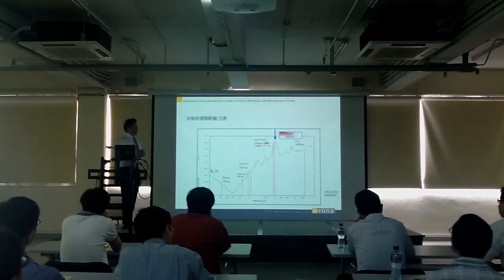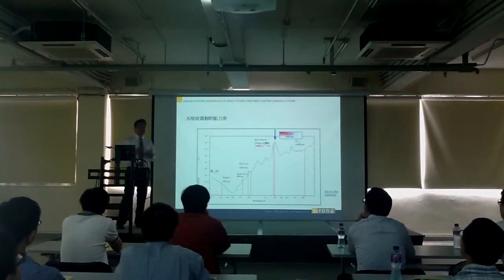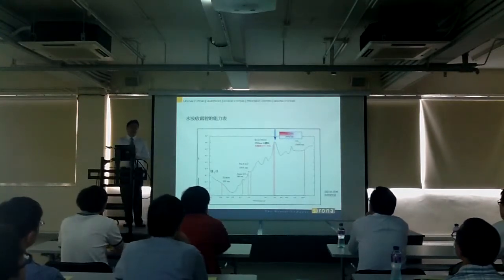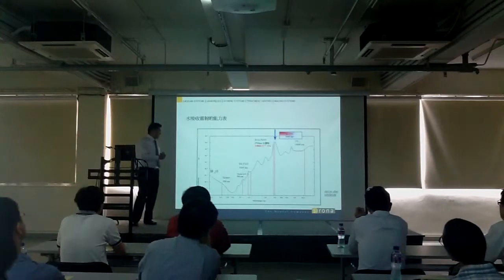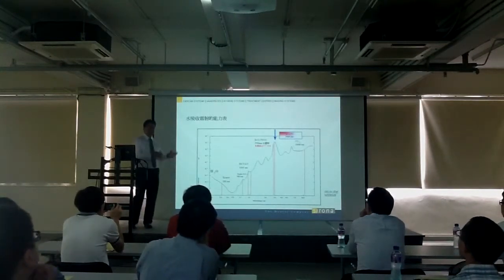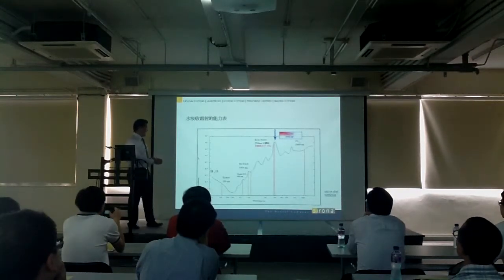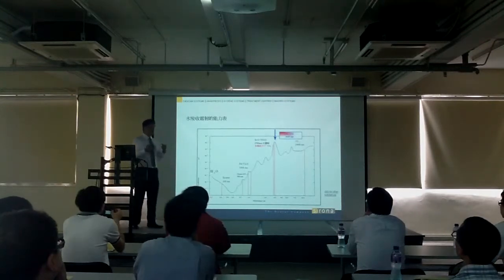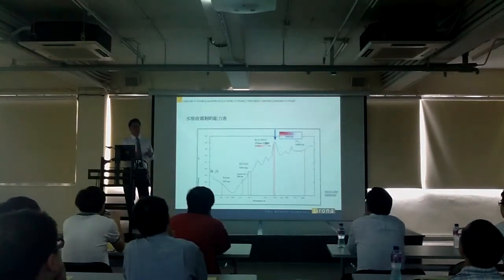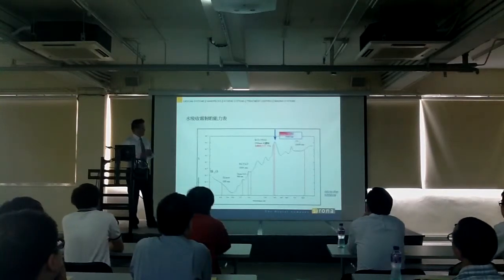Now, earlier we talked about how the erbium YAG laser works by looking at water molecules. Every time you talk about laser, you always see this graph. Some people get sick of looking at it. This line is the water molecule at different wavelengths, its ability to absorb energy from the laser beam.